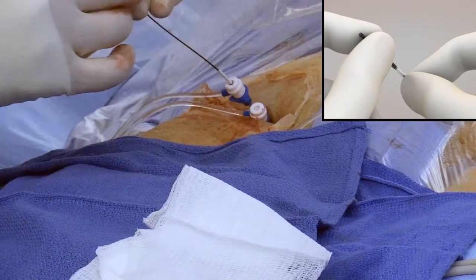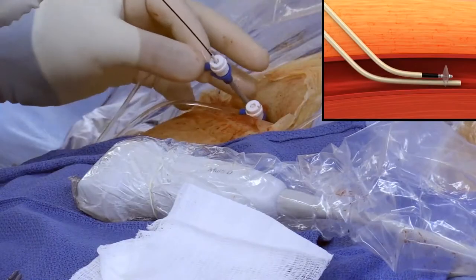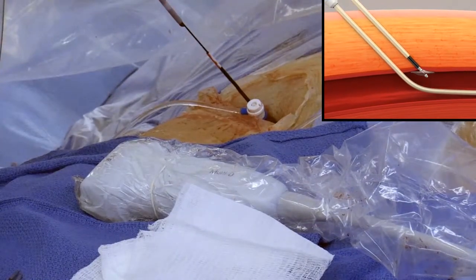Deploy the disc by separating the black actuator and silver handle until a detent is felt and the green segment remains visible. Remove the sheath over the device and position the disc against the vessel wall to achieve temporary hemostasis.